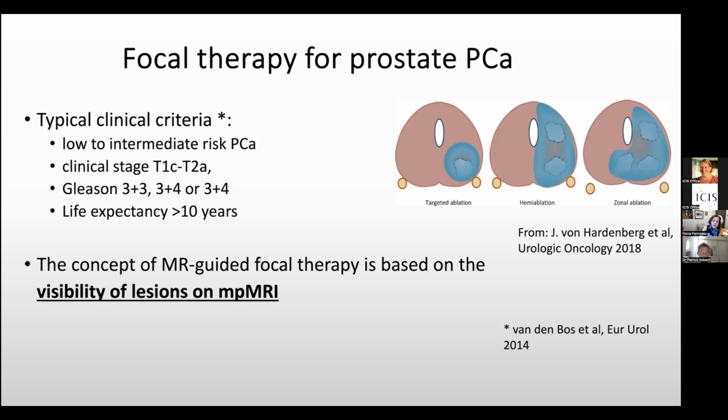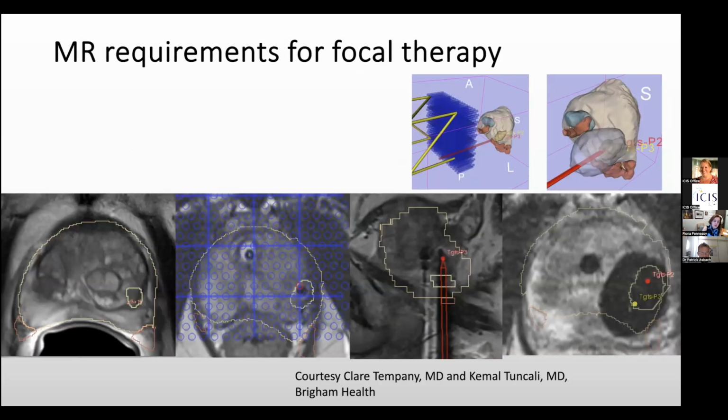When we think about the requirements, for example, this is a tumor that's right here, and you can see that the little red here is an area that's going to be ablated. Over time, you can see the targeted area, and we get this large ice ball, actually monitoring intraprocedural MRI ablation, and you can see that it's nicely monitored.